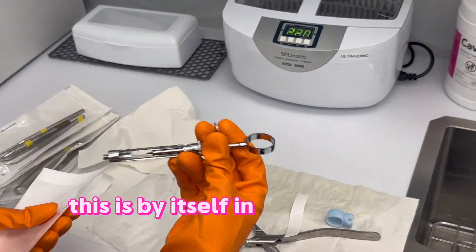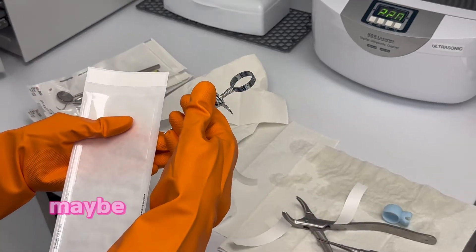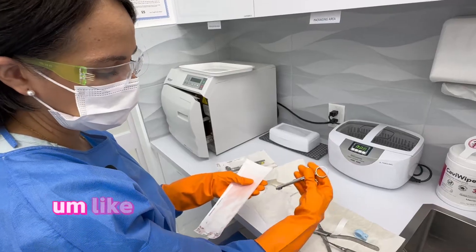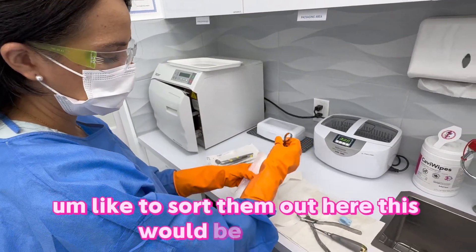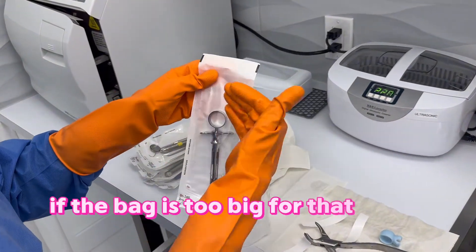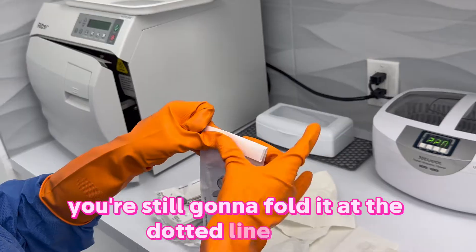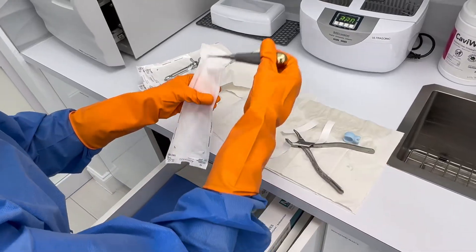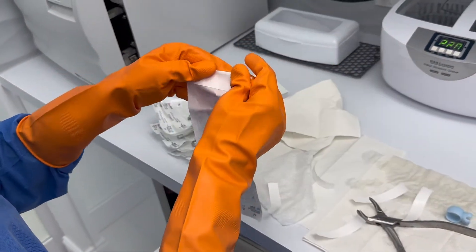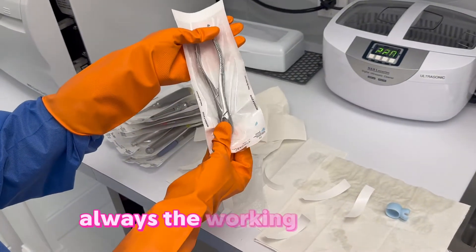In some offices they would group instruments with the procedure — for example with the crown procedure instruments — it will depend on how your office likes to sort them. Here this instrument would be by itself. If the bag is too big, you're still going to fold it at the dotted line, not past it. Always place instruments with the working end down.